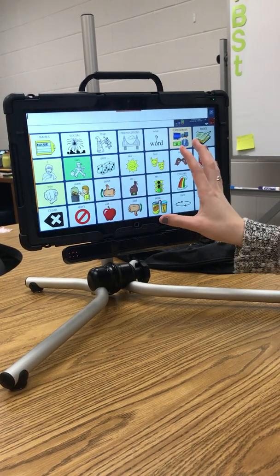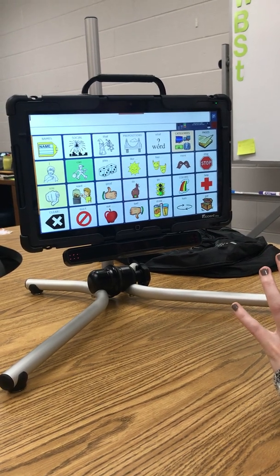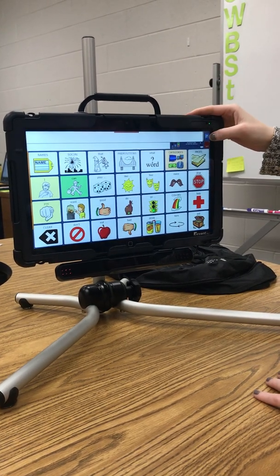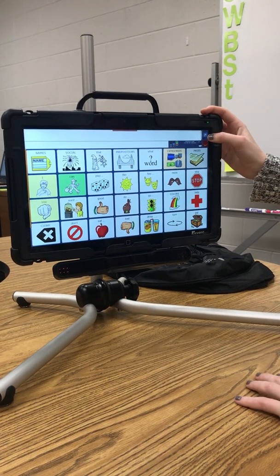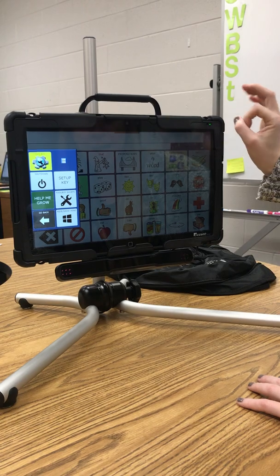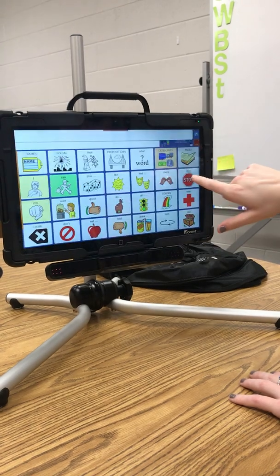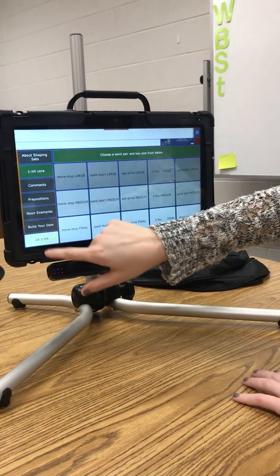And so this is what we want to work towards. Actually, I'll show you what you need to keep doing just for the video, and then I'll show you what we're working towards. So once you have all the settings done, which we do now, then I usually hit the settings toolbox icon, help me grow, grow, access, core, and then these are the words that I've been using with Meg.